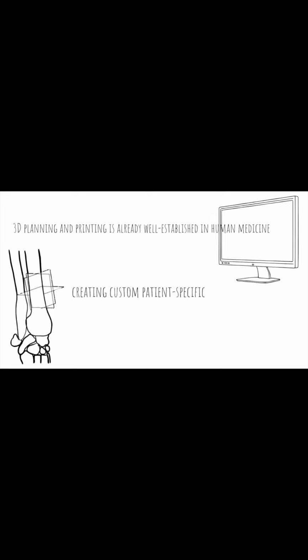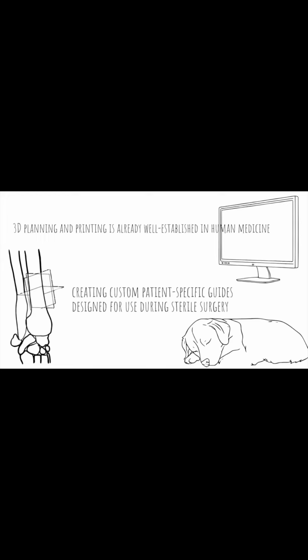Computer-aided design for three-dimensional planning and printing is already well established in human medicine across various specialties, including orthopedics. It's particularly suited for bone deformity correction because bone is easily segmented from computed tomography data. This technology allows for printing bone models for practice, performing virtual corrections, and creating custom patient-specific guides designed for use during sterile surgery.